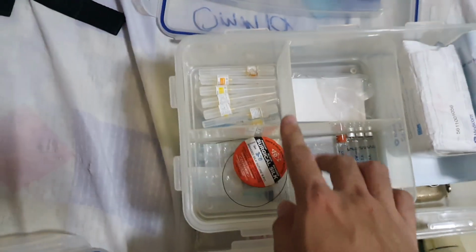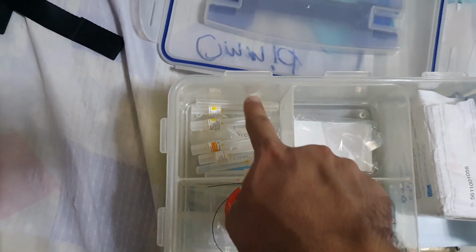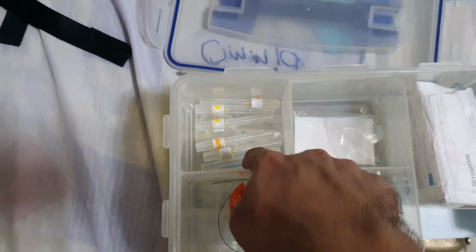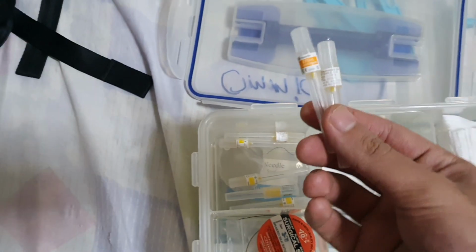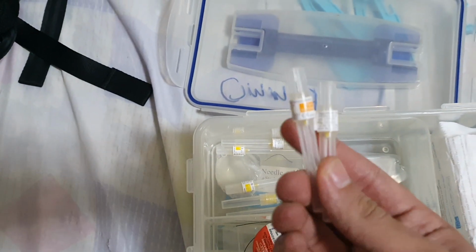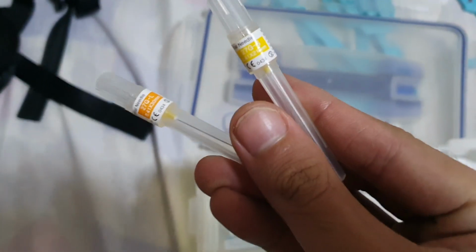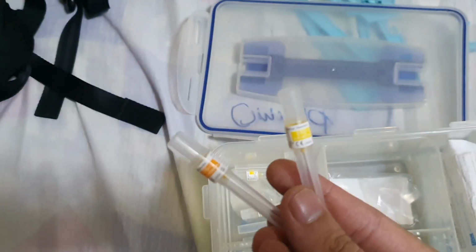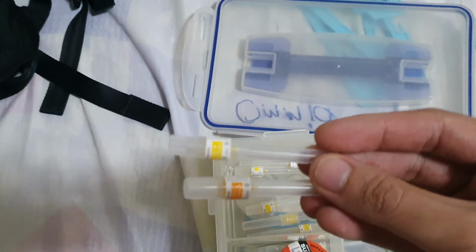So here we have my needles container. We have the short needle and then the long needle. The difference between the both of them: the orange one is a long needle, and the yellow one is a short needle. So why do we have two needles in dentistry? The short needle is for the anterior.